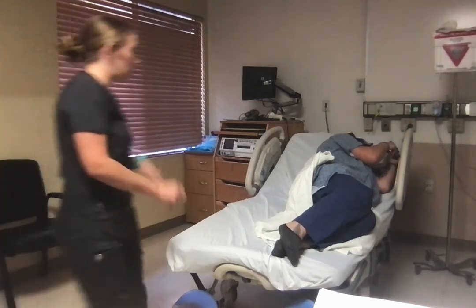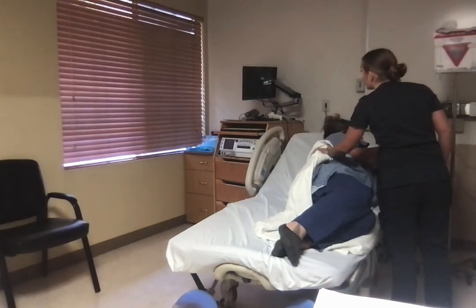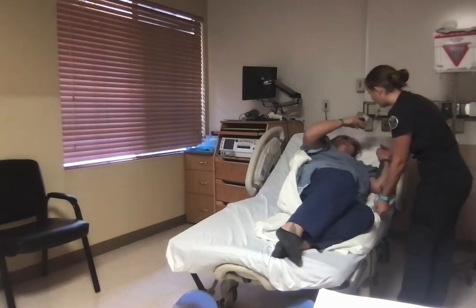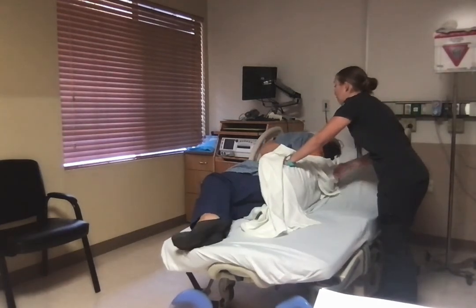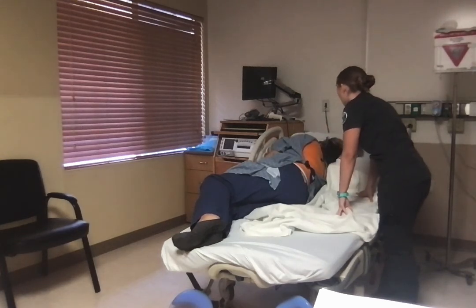Okay, Miss O'Connor, so the baby's heart rate was looking good with repositioning, but the variable decels have come back, so I'm going to go ahead and reposition you on your other side real quick. Again? Yes. We have to move as much as we need to get baby's heart rate looking good. I'm also going to give you fluids, and I'm going to be giving you oxygen, okay?